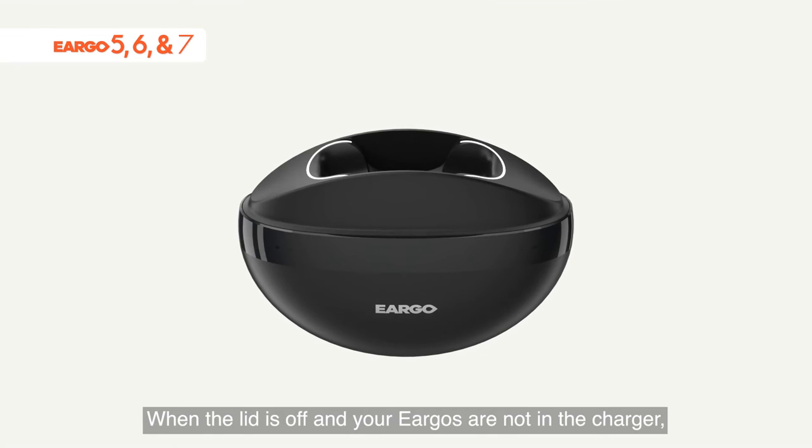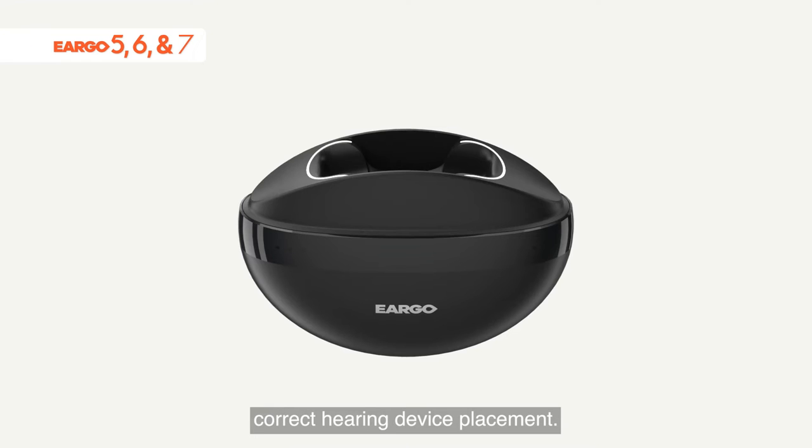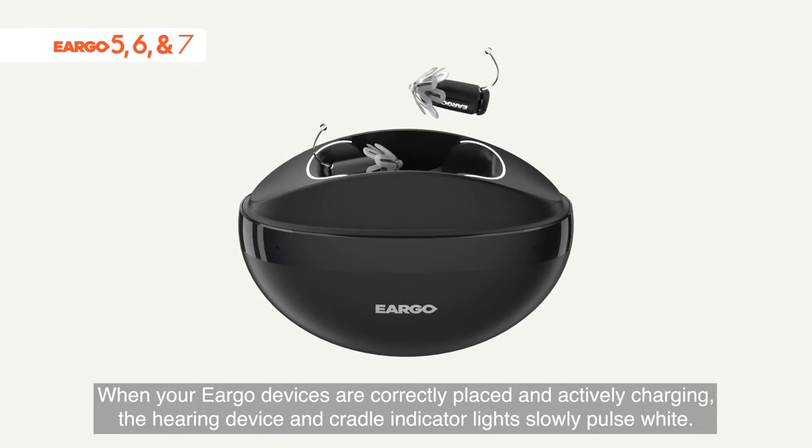When the lid is off and your Eargos are not in the charger, the cradle indicator lights illuminate in white to guide correct hearing device placement. When your Eargo devices are correctly placed and actively charging, the hearing device and cradle indicator lights slowly pulse white.